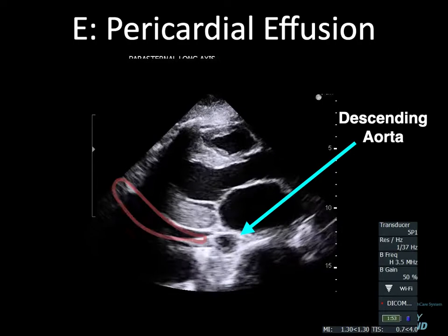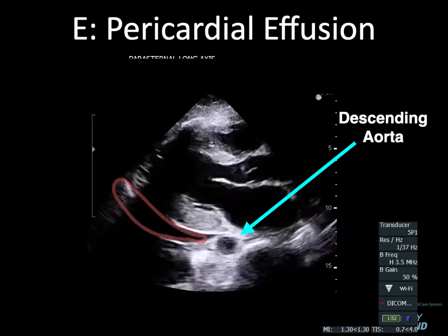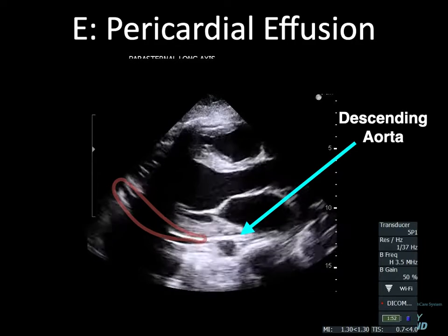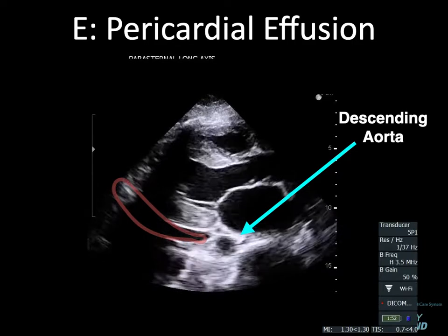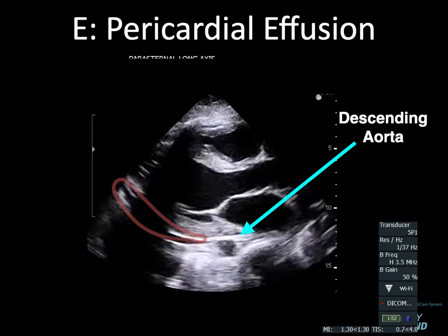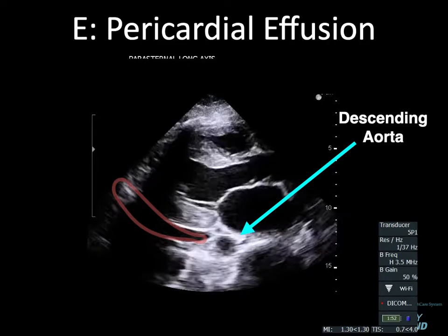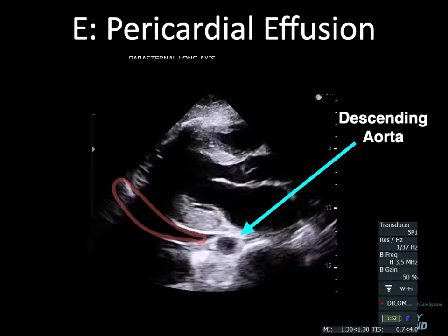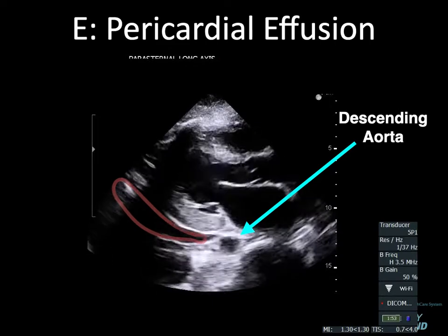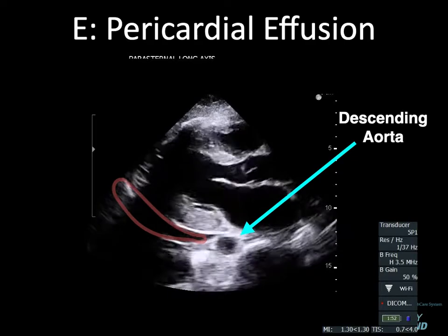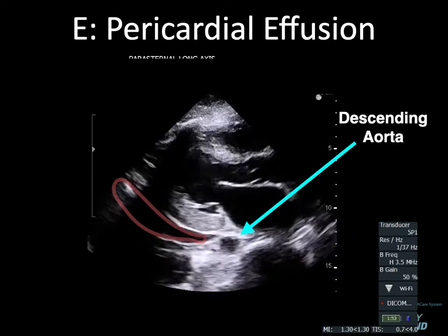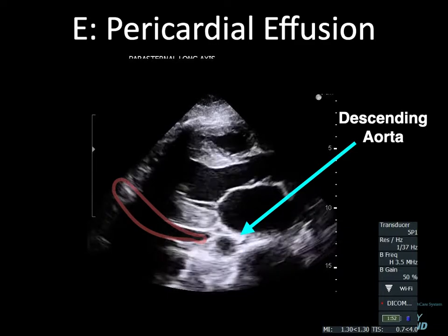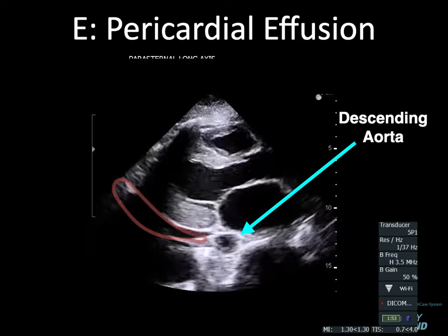The first E that we look at is the pericardial effusion — E for effusion. The key marker here is the descending aorta. This is why we want to make sure that we have plenty of depth in order to see the descending aorta and behind it. Here in our parasternal long axis, we see the bright white line of the pericardium, and we see this nice black fluid collection right there. So now we have a pericardial effusion.